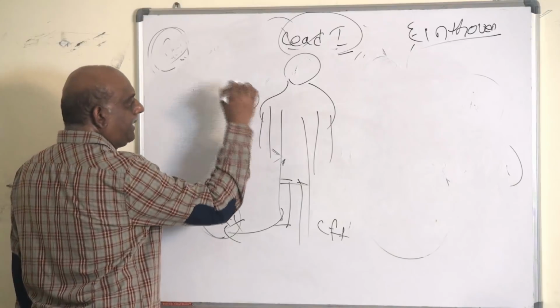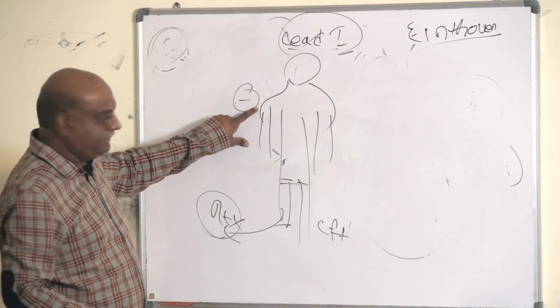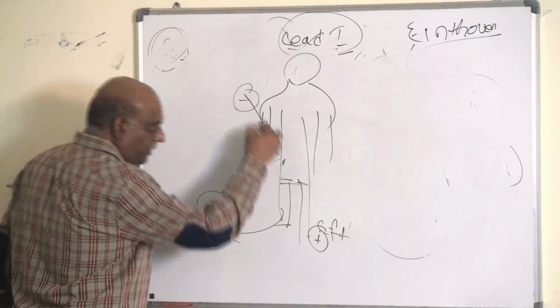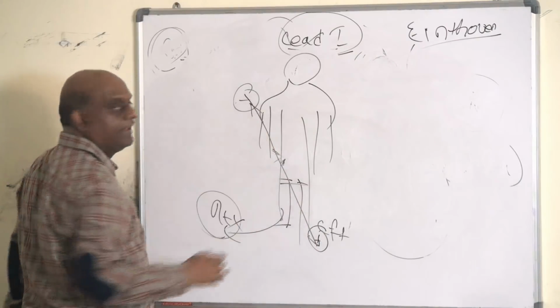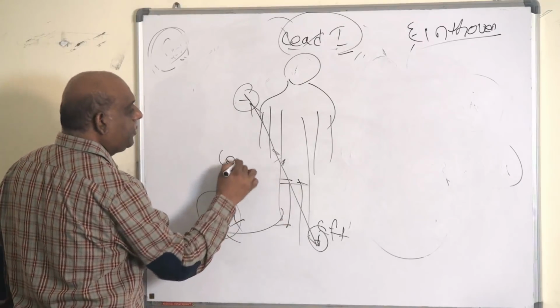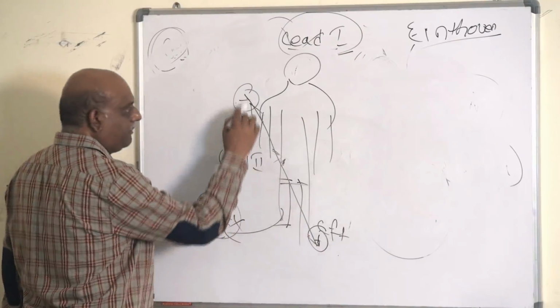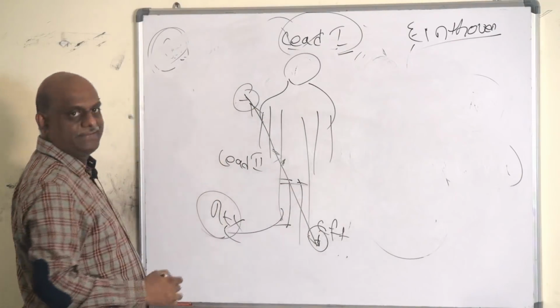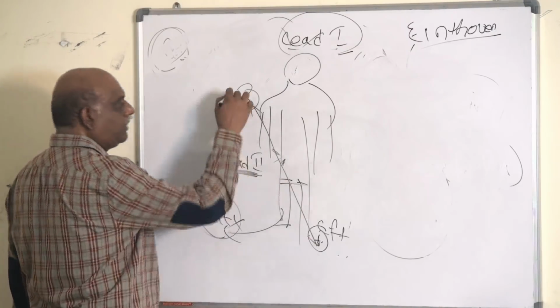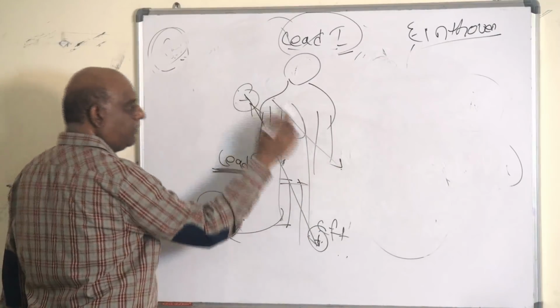So, you connected negative lead to the right arm, and the left leg you connected positive lead. You connected these two, and how is the electrical activity passing for this? This is called lead 2. How is it passing? Above to below, from the right towards the left. So that is the reason even lead 2 also is passing above to below, right to left, just like our heart. Right to left, above to below.